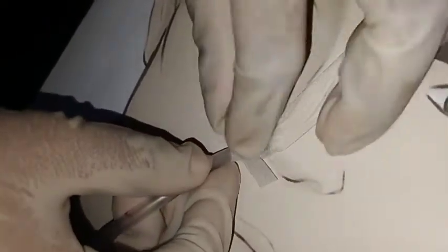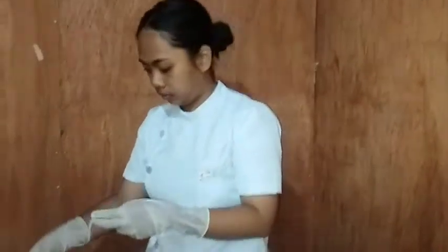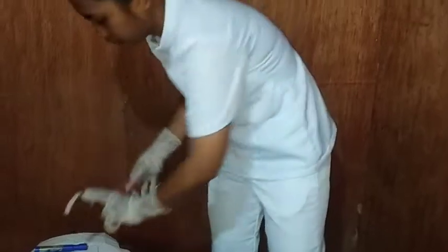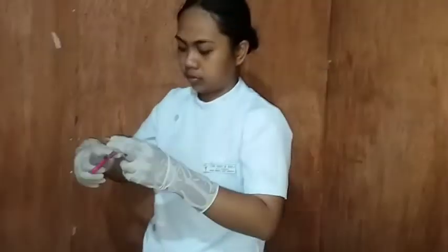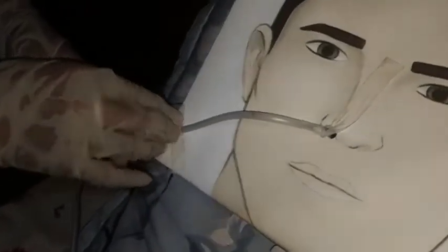Once correct position has been determined, attach the tube to a suction source or feeding apparatus as ordered, or clamp the end of the tubing. Secure the tube to the client's gown. Loop an elastic band around the end of the tubing and attach the elastic band to the gown with a safety pin. Or, attach a piece of adhesive tape to the tube and pin the tape to the gown.